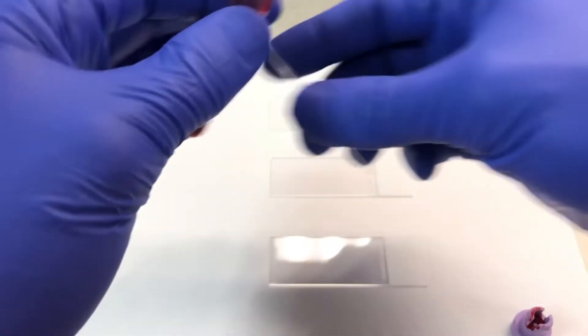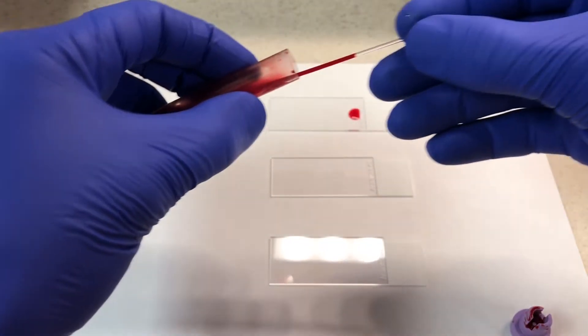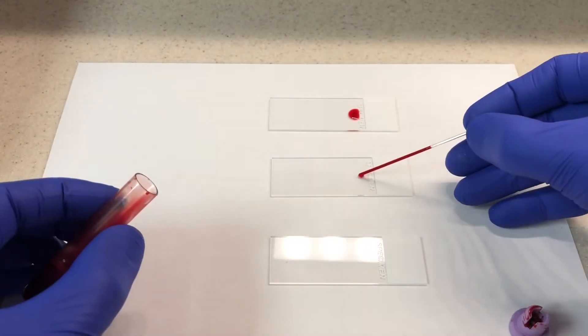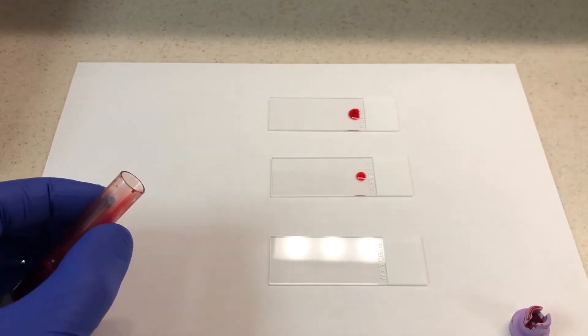Capillary tubes are also fairly common and they're quick to use. Just fill them up and dab them a little bit on the slide and you'll make a blood drop.